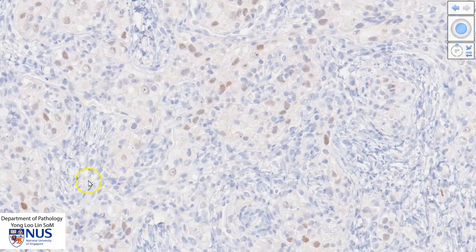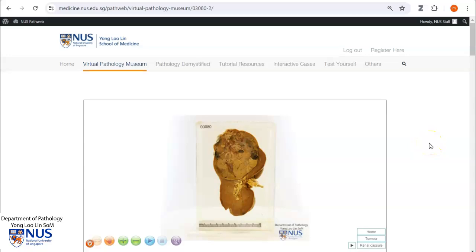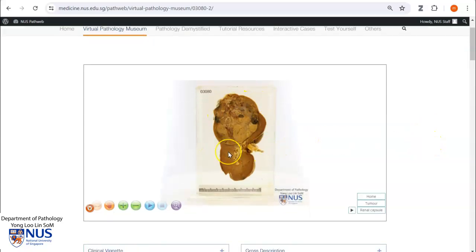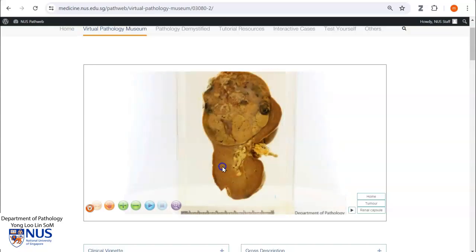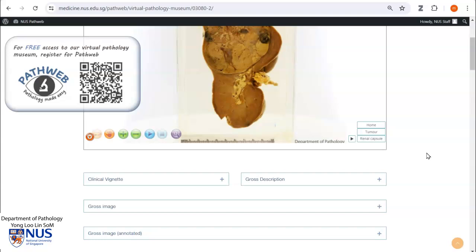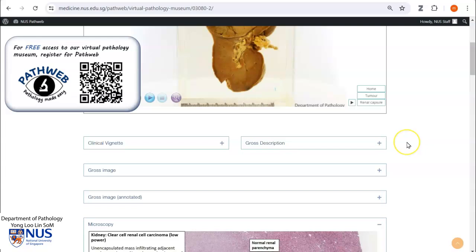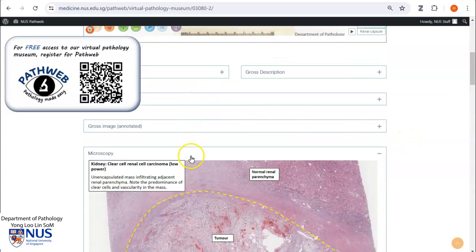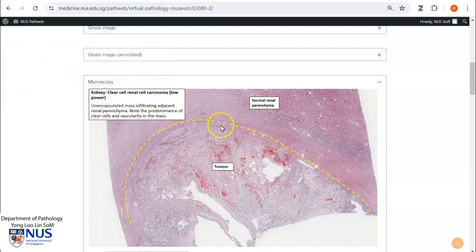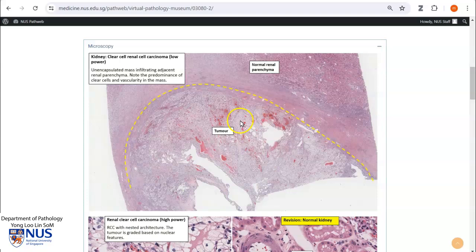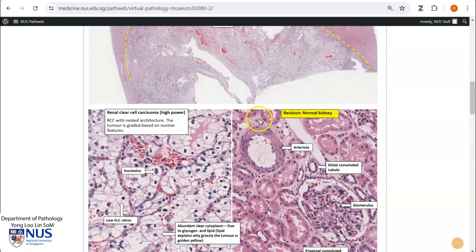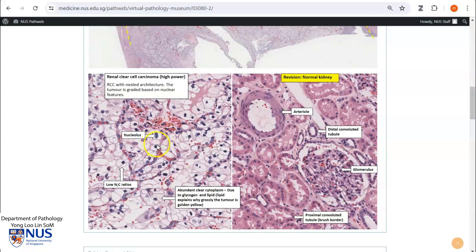Let's look at an example of renal cell carcinoma in the kidney. This is a virtual pathology specimen of renal cell carcinoma located in the primary site, which is the kidney. This virtual pathology specimen is taken from our free online pathology resource, PathWeb. The registration link is in the video description. Here is the tumor on low magnification, and on high magnification we can see that this tumor is indeed composed of these nests of polygonal cells with abundant clear cytoplasm.